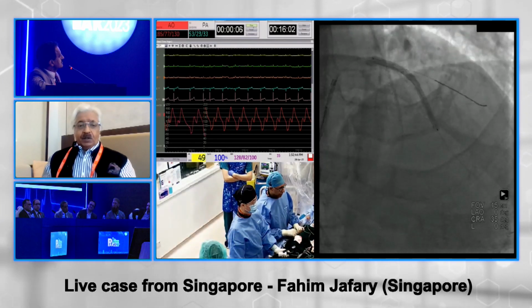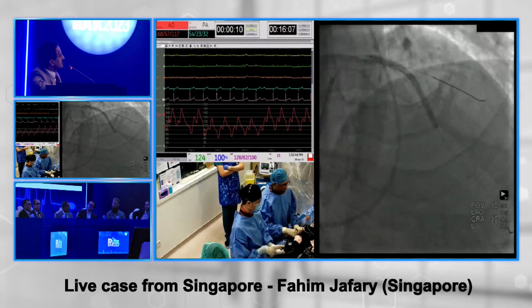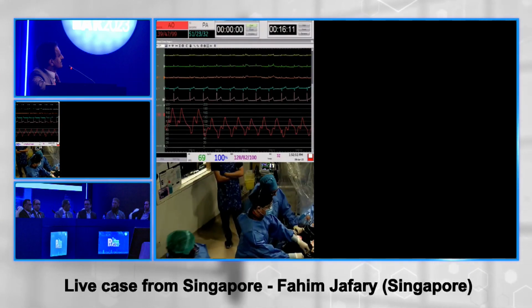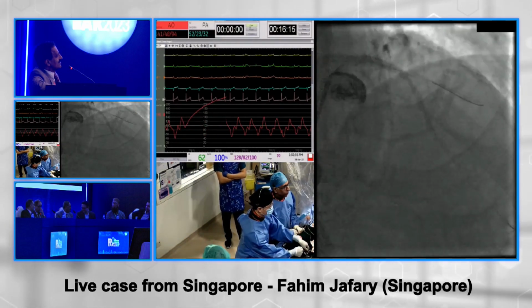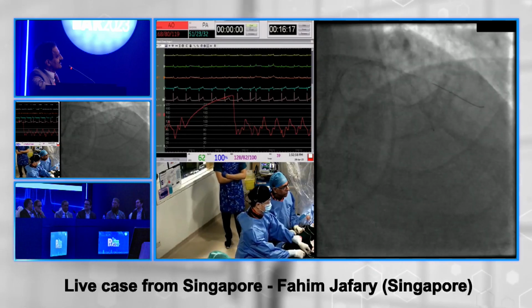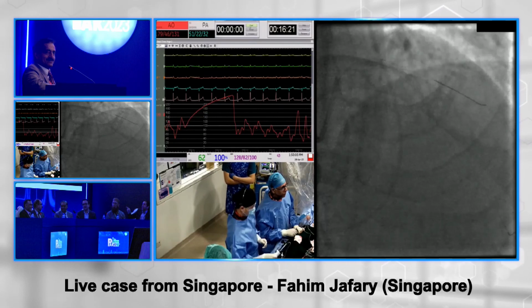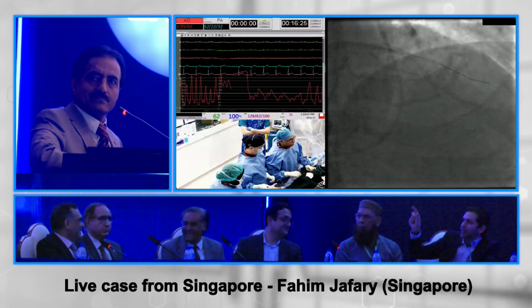The modified jail balloon, which actually traps the balloon even behind the stent, always worries me. That worries me too, Ashok. I agree with you. I just imagine the nightmare scenario that the jailed balloon rips the stent into a mangled piece of metal, and I pinch myself and don't wake up from that nightmare.